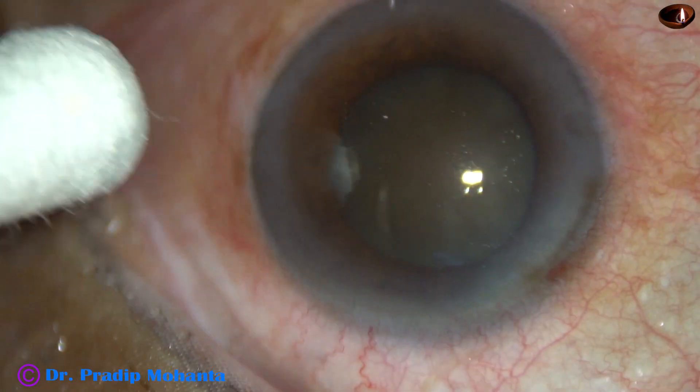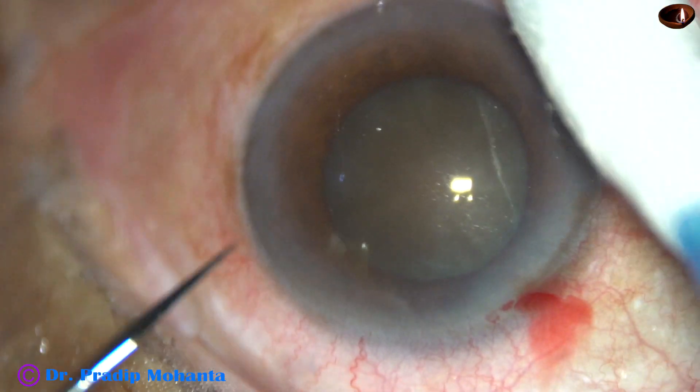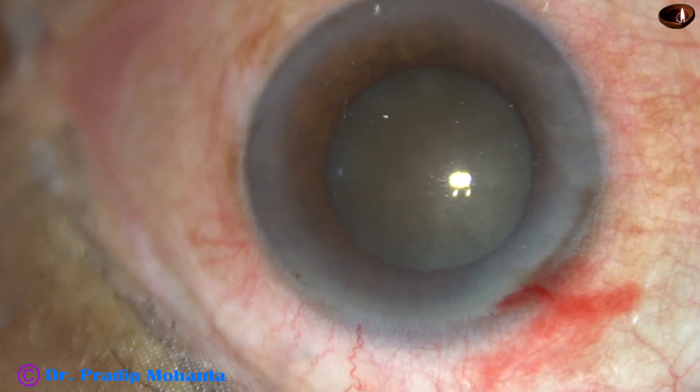This is the main incision with a 2.8 mm keratome. And this is a sideport on the left side of the main incision with a 15-degree lance tip knife.